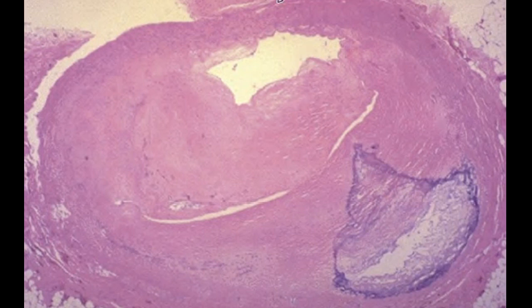So here, this is the blood vessel. This is the complex atherosclerosis which is seen, with a severe degree of coronary artery narrowing. See, this is the artery, but now this artery has been narrowed because of this complex atheroma which is present. So this is atherosclerosis. One more atherosclerosis microscopic view.